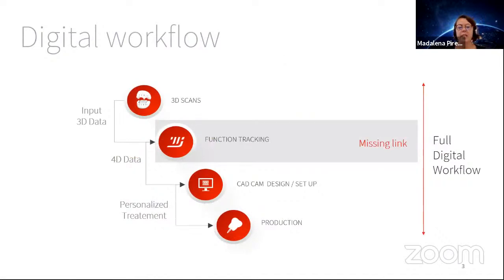I'll talk a little bit about the digital workflow. So we have the input 3D data. Most of our customers already own an intraoral scanner. We are open to all intraoral scanners. So I could give you examples. A lot of our customers will have a Cerec scanner or an iTero or a Trios or a Primescan and so on. Today they're all open intraoral scanners. We can use the data and mostly also in color.